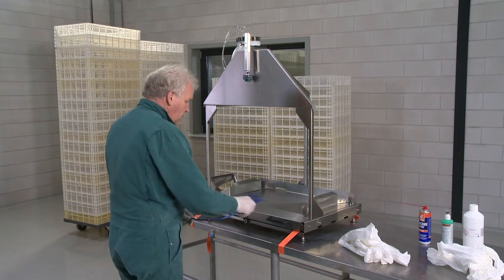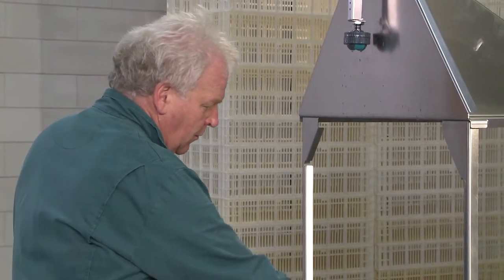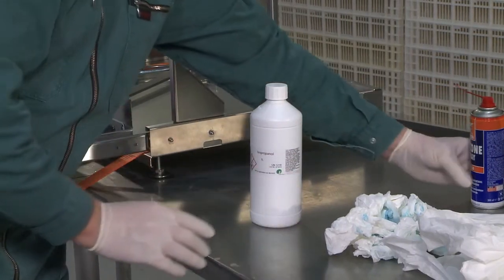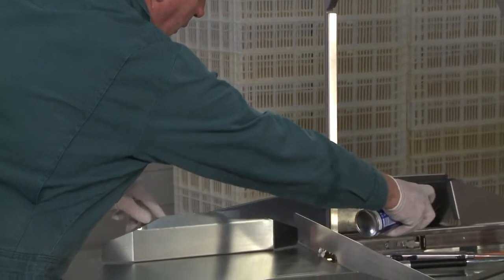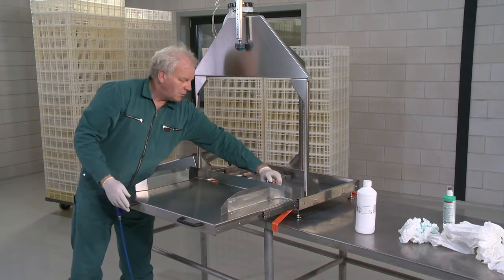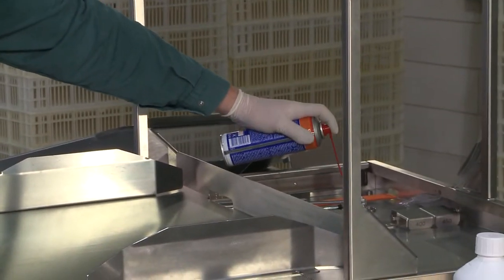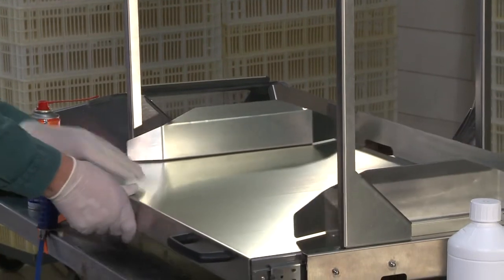After cleaning the Nobilis spray, dry it completely by using compressed air. Pay particular attention to bearings on the left and right side of the drawer, as well as the absorber and the cylinder piston construction. Residual water can reduce the durability and lifespan of the device or cause damage, for example corrosion. All moving parts, for example cylinder piston construction, absorbers and bearings, have to be lubricated with silicone or food-safe oil.